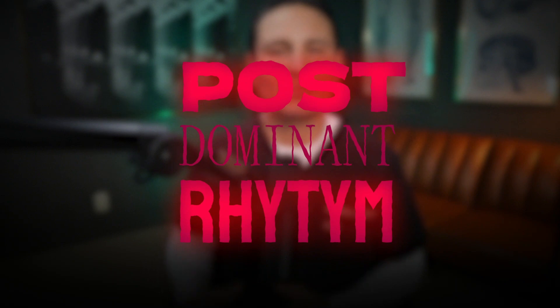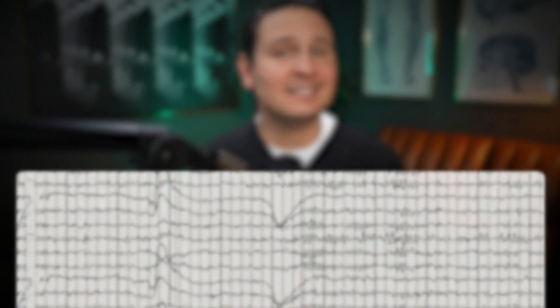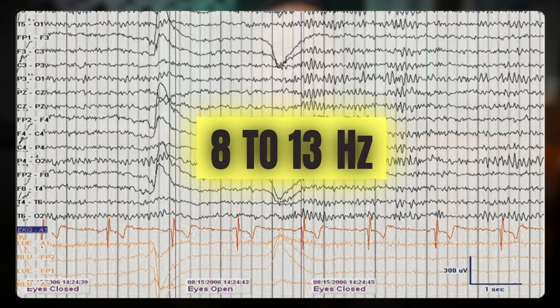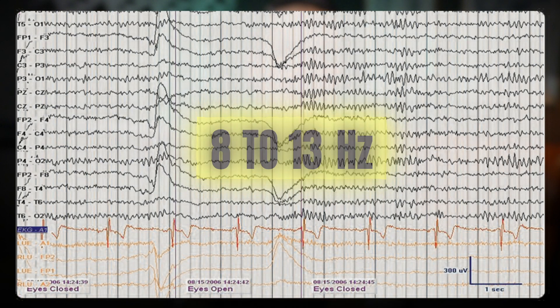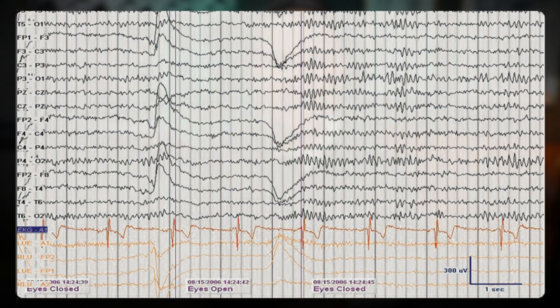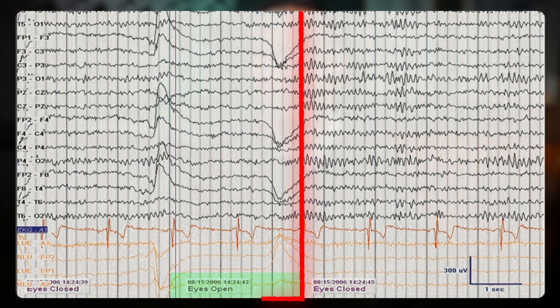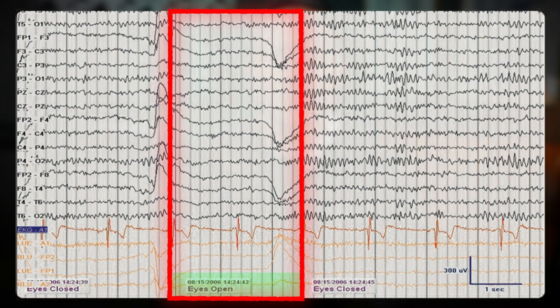It typically lies within the 8 to 13 Hz bandwidth, which classifies it within the alpha frequency range. A key characteristic of this rhythm is its attenuation with eyes opening, which you see here, where the normal 10 Hz alpha rhythm is blocked by eye opening and reappears upon eye closure.